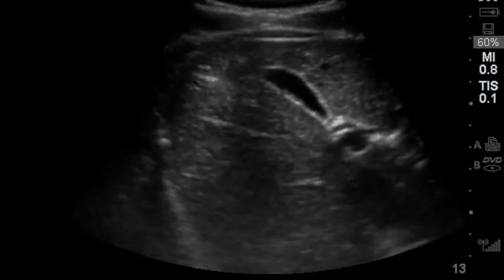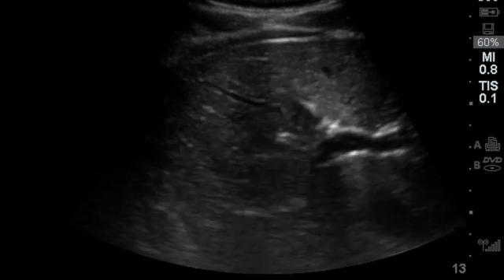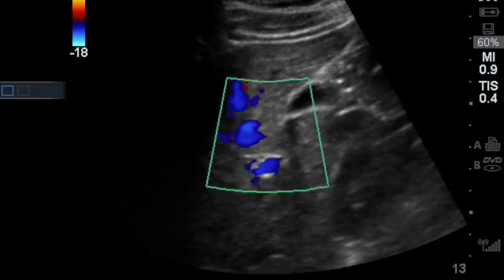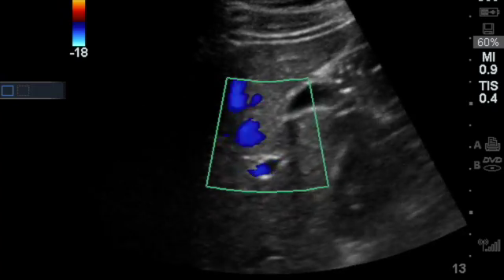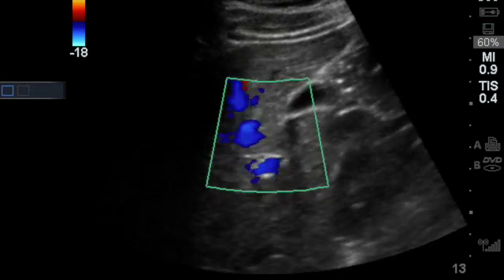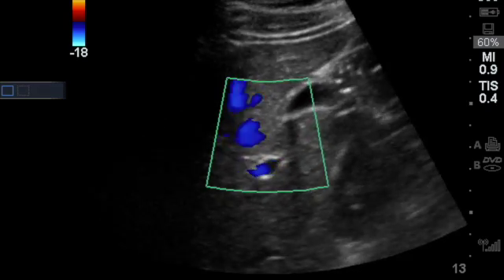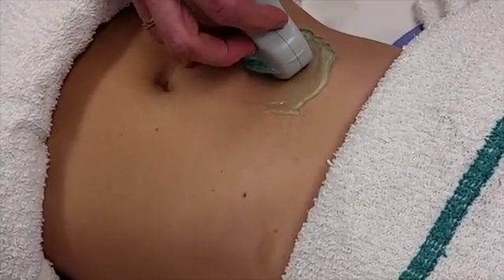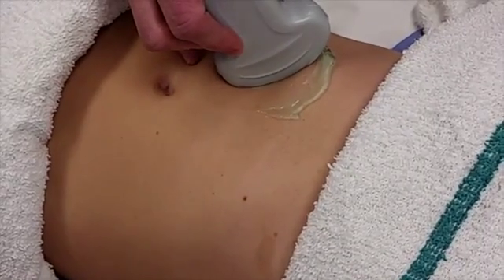Fan the probe until you find the anechoic black gallbladder. If you have any doubts, you can put color flow on the structure and confirm that it is not vascular. After you find the gallbladder, slowly rotate the probe to get the gallbladder in long axis.